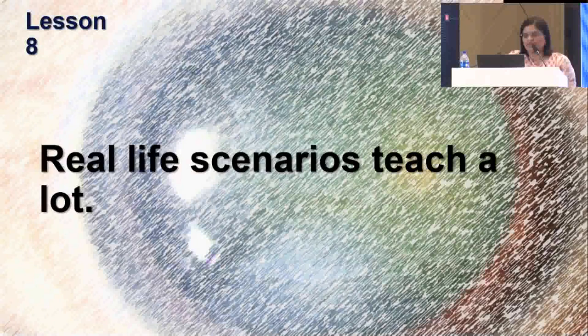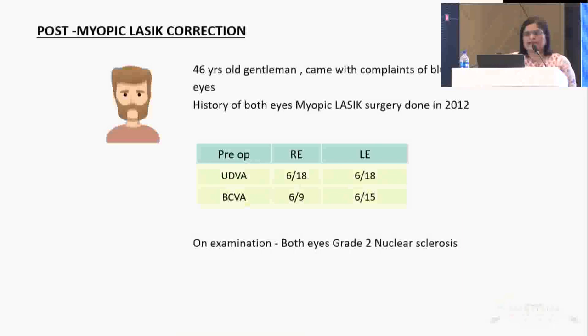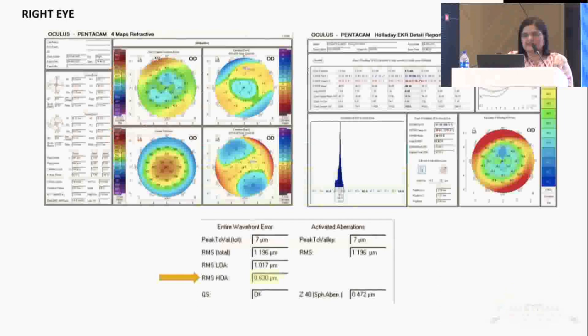Now coming to the last lesson, which is about real-life scenarios. I'll talk about a post-LASIK patient. This was a 46-year-old gentleman who came with both eyes myopic LASIK done in 2012. The right eye had UDVA 6/18 and the left eye 6/18 again. BCVA was 6/9 and 6/15. Both eyes had nuclear sclerosis, grade 2. Here the higher order aberrations were slightly on the higher side, 0.6.